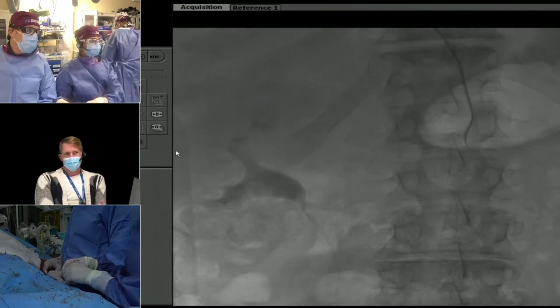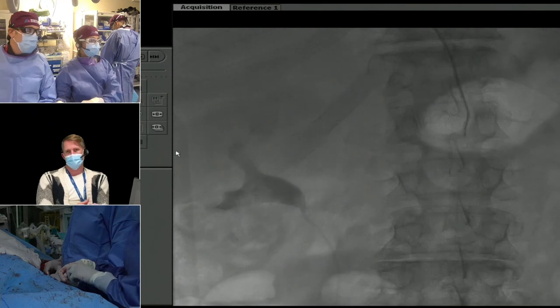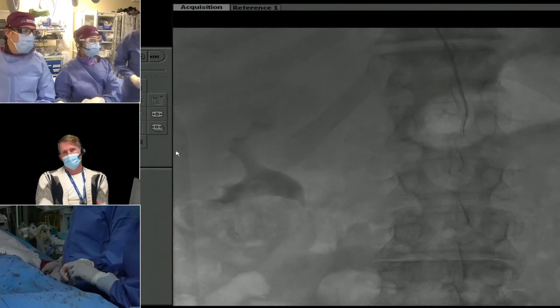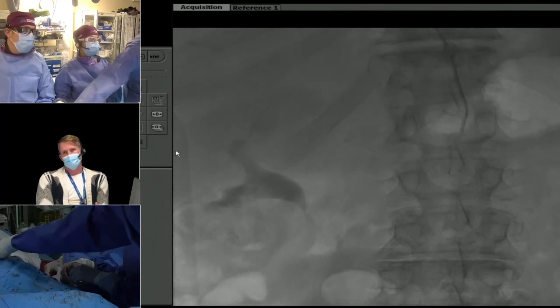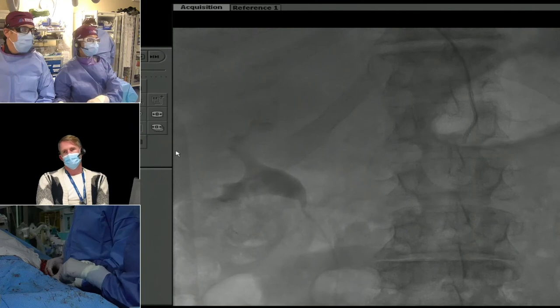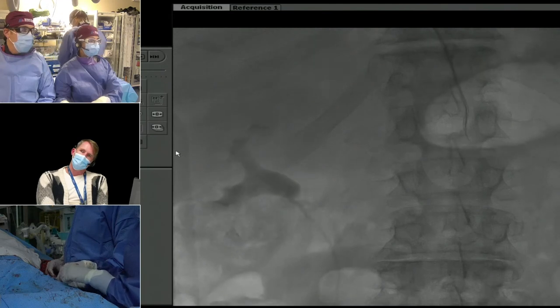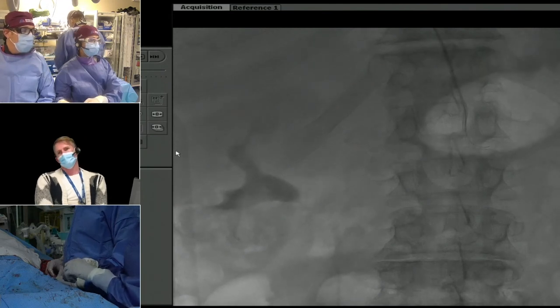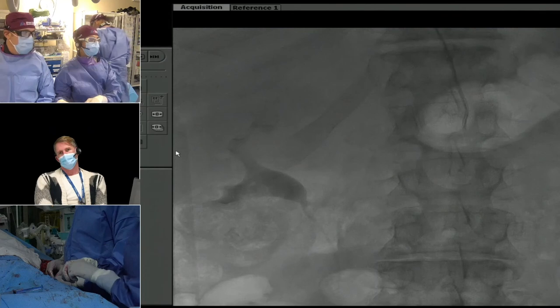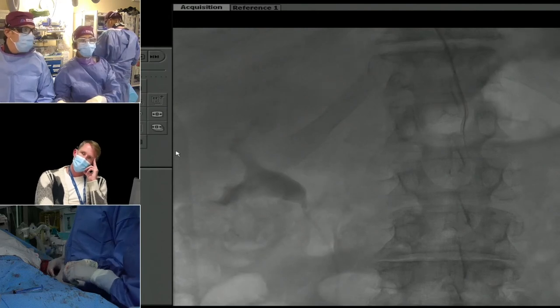So you were talking about preserving his renal function earlier. Does his baseline renal function play a strong role in whether you decide to embolize these patients? No, because most small T1A lesions, when you ablate, have no negative effect on kidney function in a normal ablation. So I'm not worried about that. From the embolization perspective, you could get reflux and definitely create more non-target embolization from aggressive embolization. Not that we would do that with a standard microcatheter, but having some sort of anti-reflux effect makes sense, particularly with this end hole.